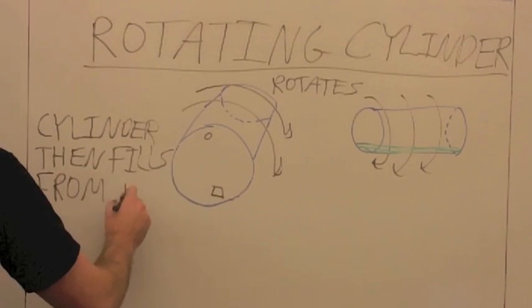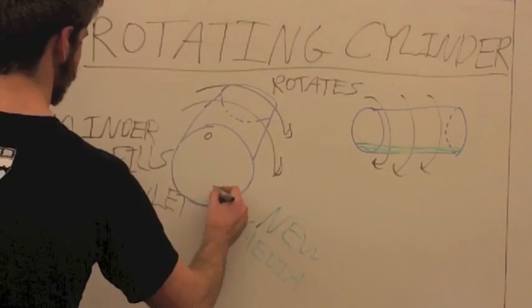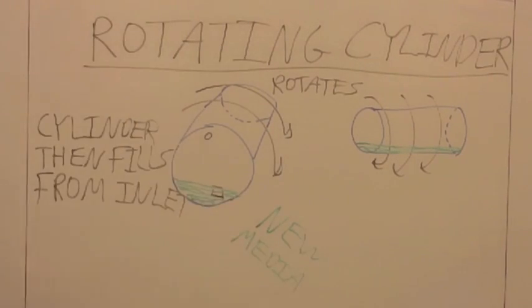The pace of the media removal and replacement is set by the period of rotation. Because the valve only drains and replaces the media once per cycle, the timing can be adjusted based on the speed of rotation.